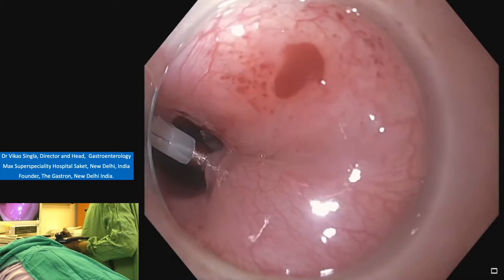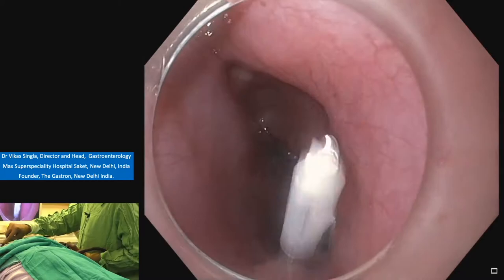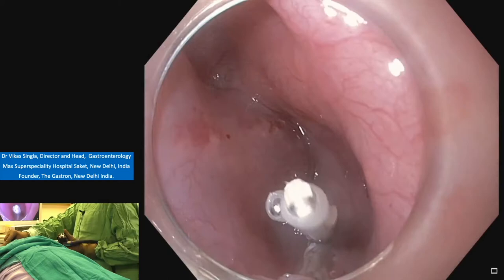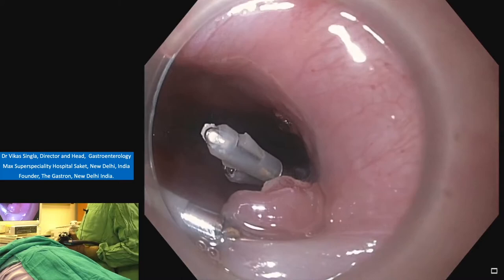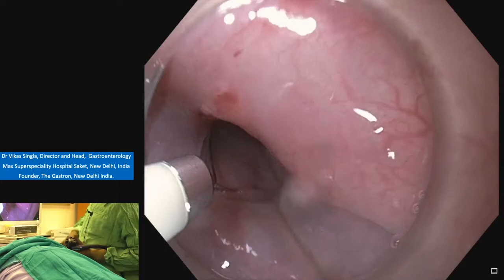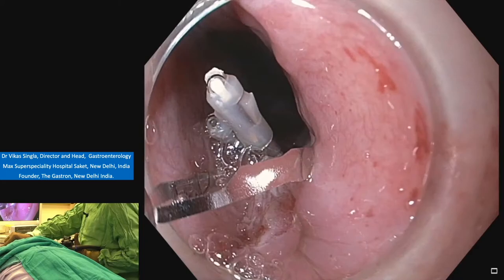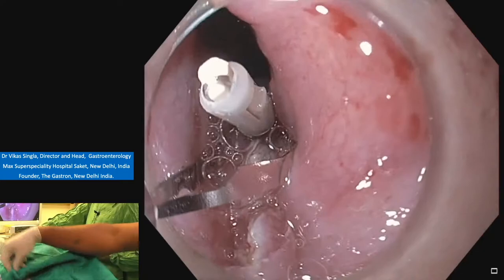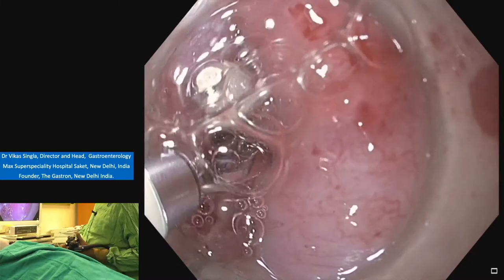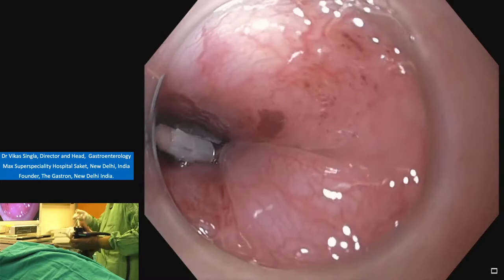There is some difficulty in applying the clips. I think that's because of its non-dilated esophagus. Open, open, then rotate, horizontal clip position, and then pull back, localize the area, hold it, so everybody should be vigilant, hold it here. On fire. So again, both the margins are there. That completes the closure. Now we go inside again.